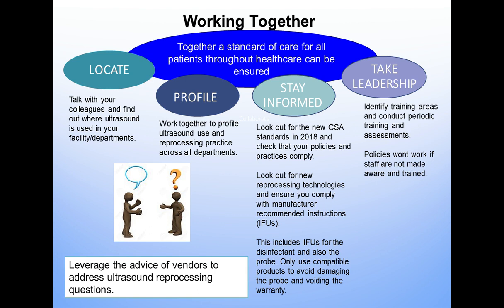And I just wanted to leave you with one last piece of advice, and that is to leverage the advice of the vendors to address ultrasound reprocessing questions. So you can ask questions of the ultrasound manufacturers, you can ask questions of companies like Nanosonics that provide products into this area, and really, feel free to lean on those people for additional information.